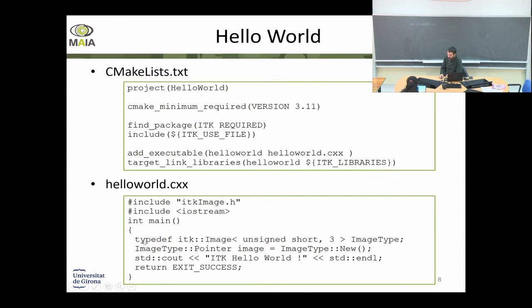ITK will have lots of typedefs. You're going to see lots of typedefs. You know what typedef is? You define a new kind of type, a new kind of variable, if you want. Well, not variable, a type of variable. Is it just a name for another, like a long type? Yes. It's just that you are declaring a new type. You know, you have int, short, long, char, etc., strings, whatever. So basically, you will create a new type, so you can name this new type and use it afterwards.